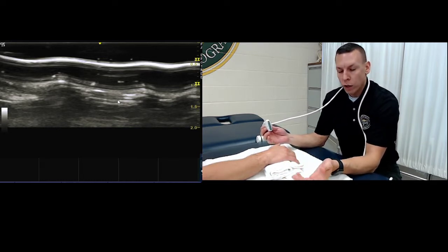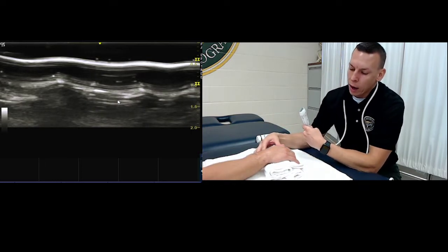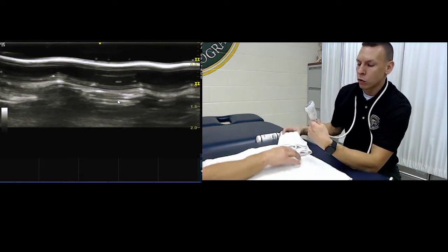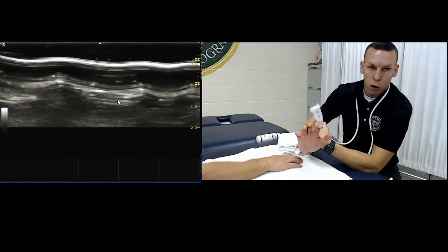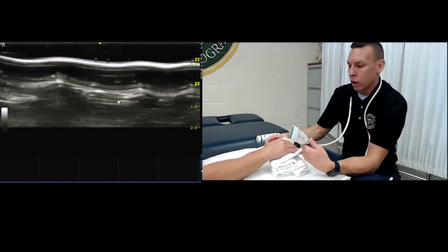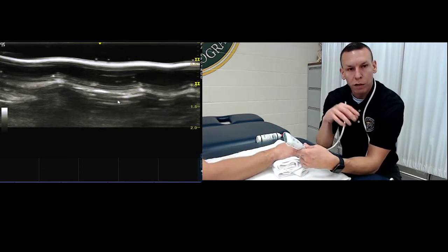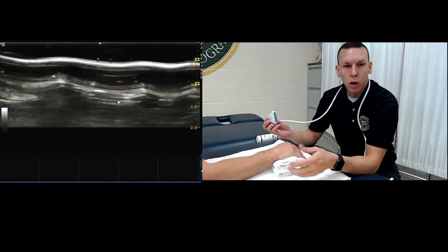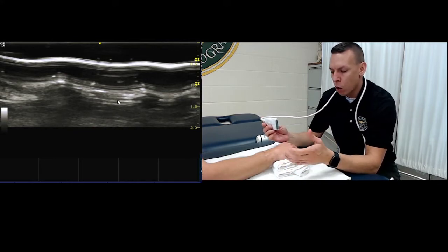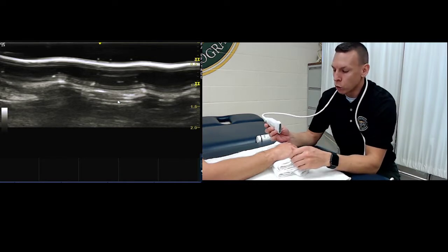So for the wrist and hand, the initial positioning I like to use is a towel to try to get the wrist flat. If they didn't have the towel, usually what will happen is the wrist might go into a little bit of extension. So if you position a towel underneath the hand, it allows the wrist maybe to go into a little bit of flexion, and that should help you image your structures a little more easily. And then having a towel as well for some of the other images is useful as well.